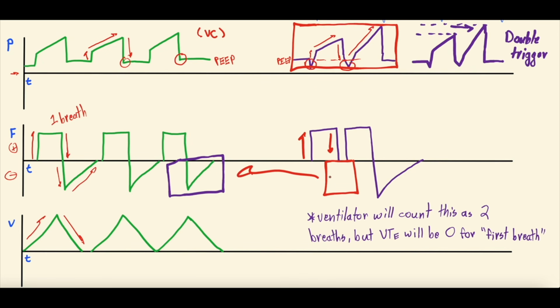They're still trying to suck air in. They're not breathing out. So then you get a second flow scalar waveform before you get this big breath back out, of the air flowing out of the lungs back to the ventilator. So the flow scalar will essentially just show 2 inspiratory flow waveforms without the normal expiratory flow because that patient has not breathed out yet.